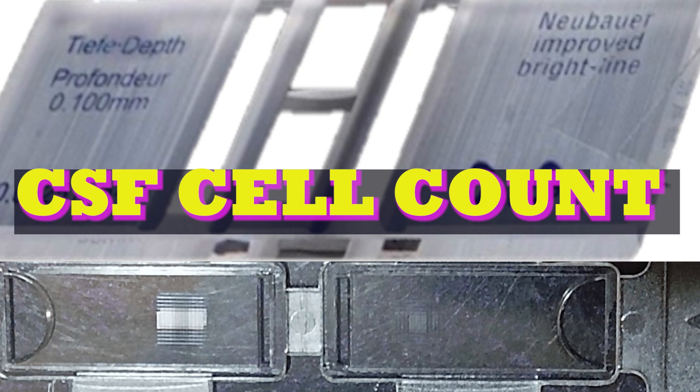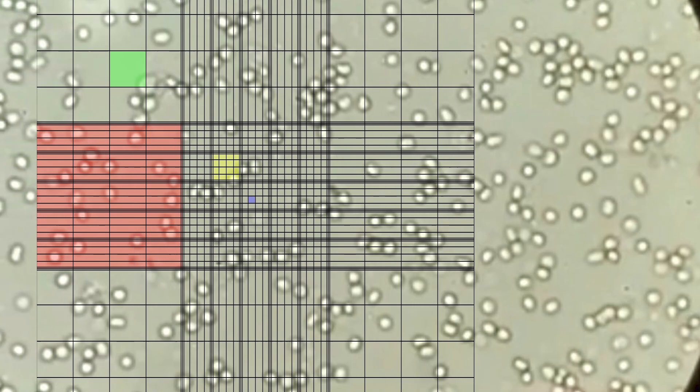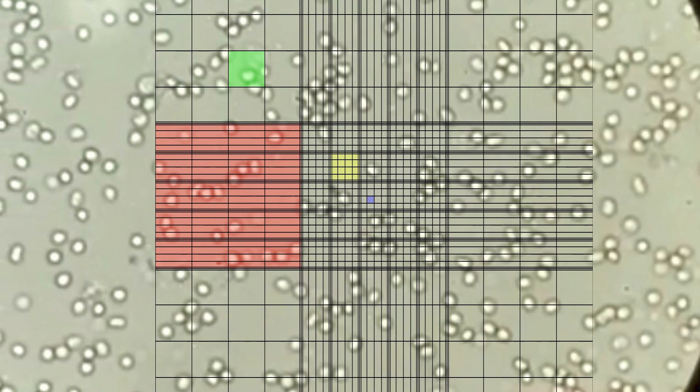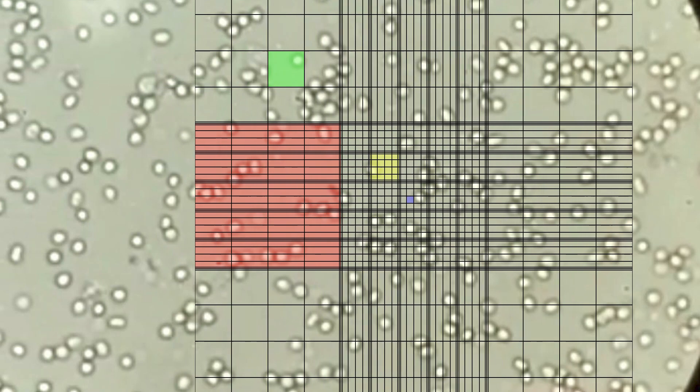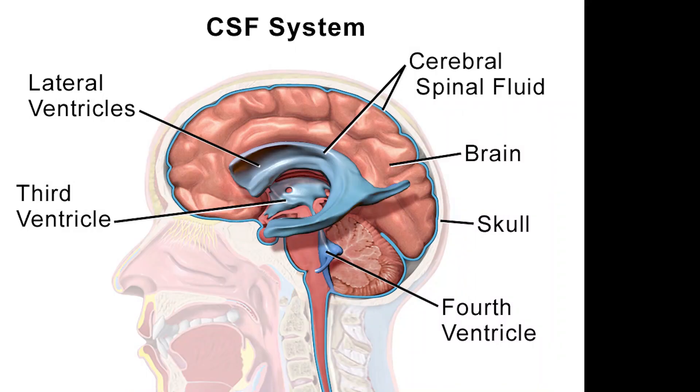Hello friends, welcome to TechQuest channel. This is for the medical techs by your tech. In this video we are going to discuss about CSF cell count. You'll be able to do this test confidently after watching this video.